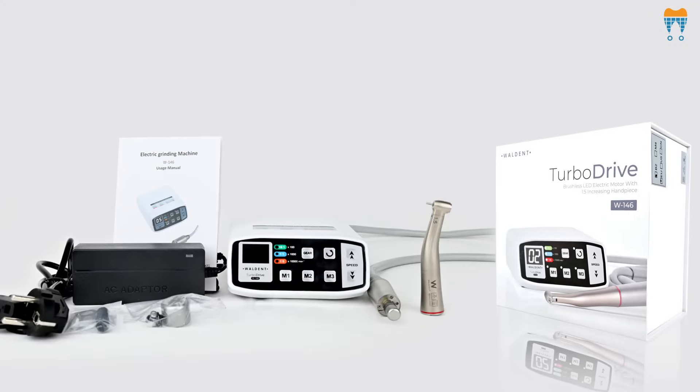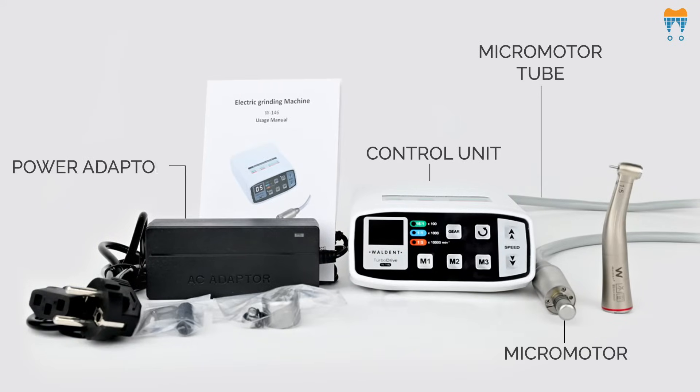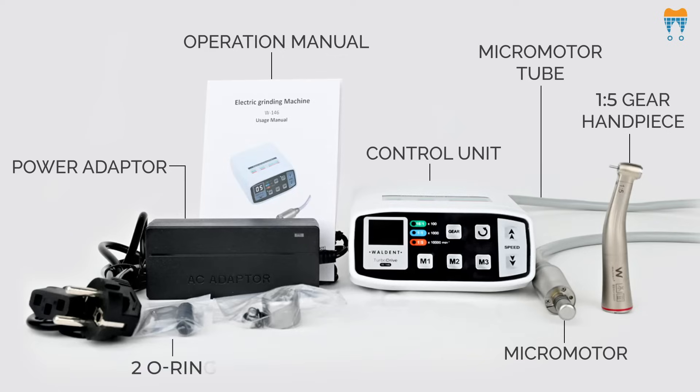Let's see what we get in this box: Micromotor, Control Unit, Micromotor Tube, Power Adapter, Operation Manual, 1 Ratio 5 Gear Handpiece, and 2 O-Rings.